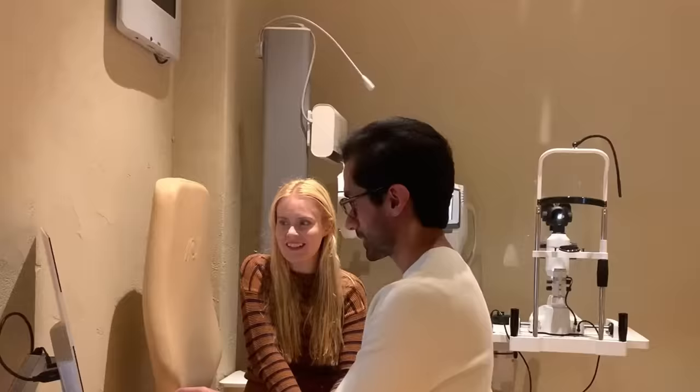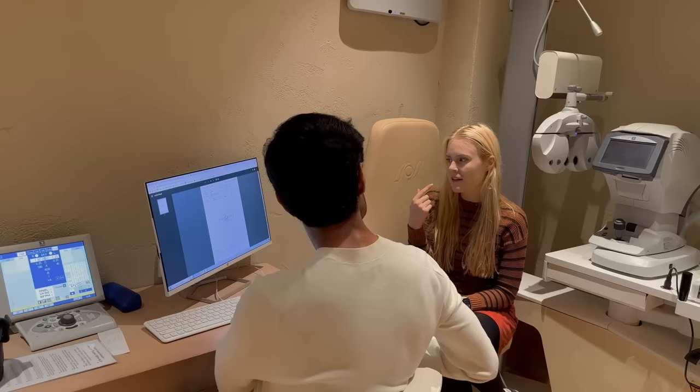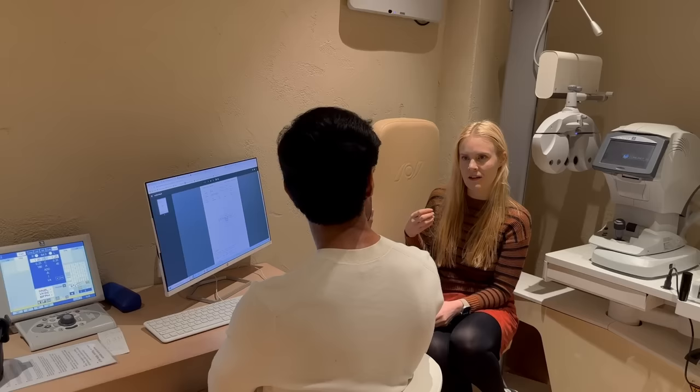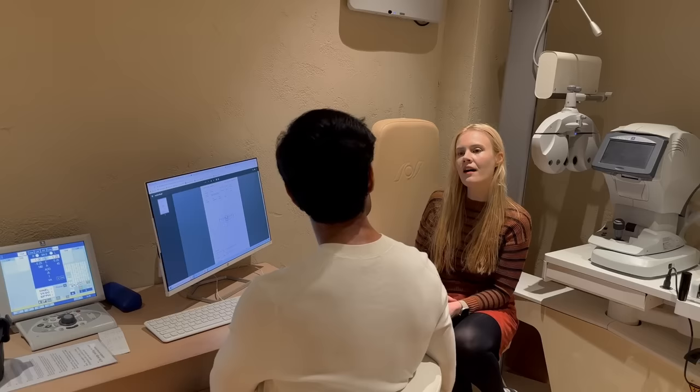It's a bit unrelated to this one, but yeah. So with the puff of air, how is that testing? Is it testing my eye's reaction to the air? Yeah, when that machine pushes air into your eye, it gives a bit of pressure back, and then the machine's reading that. So yours is about 15, middle of the range.